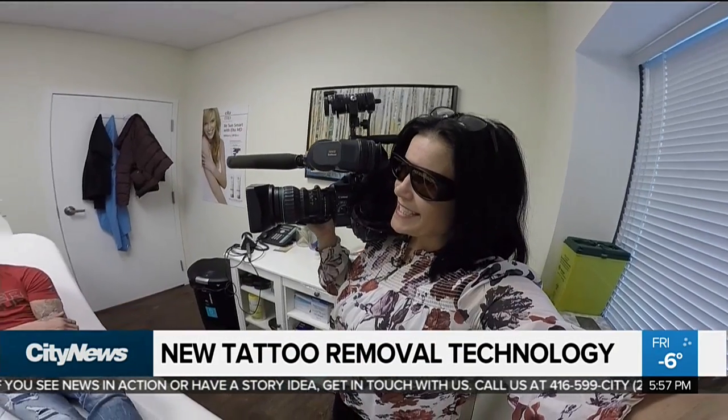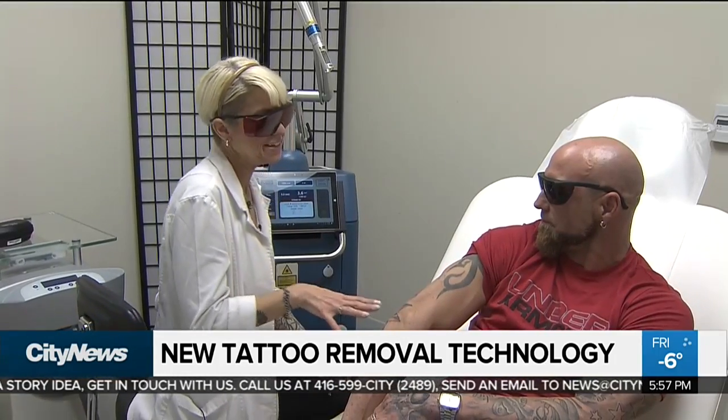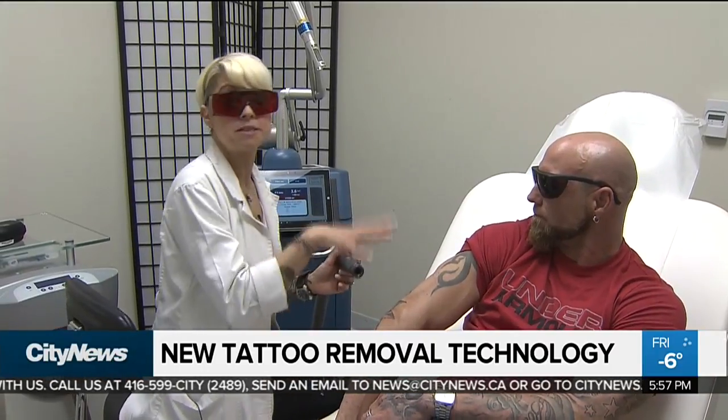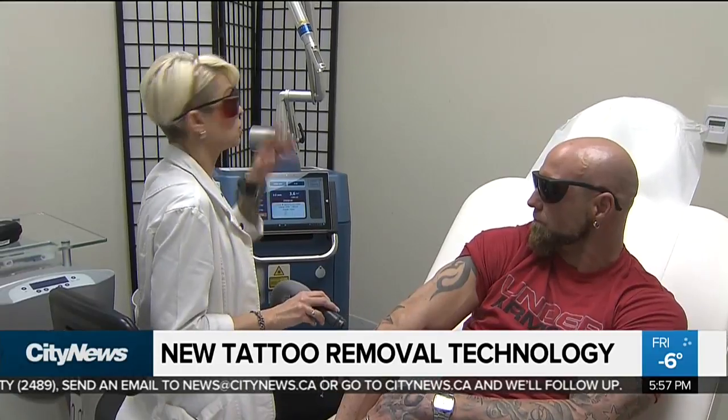Why do we have to have these glasses on? We wear these glasses basically just to protect our eyes from the laser. This is Pat's second treatment. So what we're going to do is blow the zimmer on the area first just to help chill the area, and then we're going to begin the treatment.